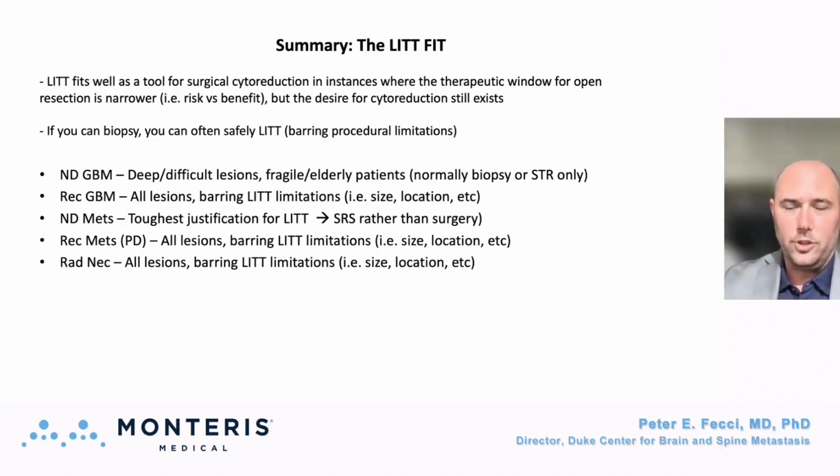And so let's go through the tumors. For newly diagnosed GBM, this is going to be deep or difficult to access lesions or fragile or elderly patients who might only be a biopsy or subtotal resection only. In recurrent GBM, LITT's going to be appropriate for basically all lesions, barring the limitations of the procedure itself, i.e., is it a large lesion that's not safe to treat?